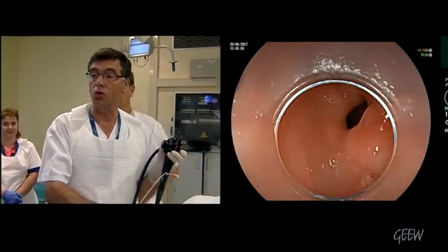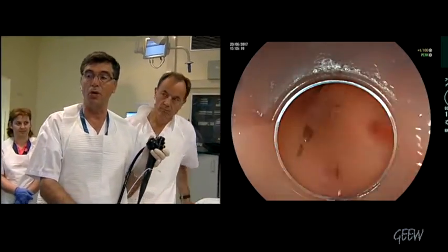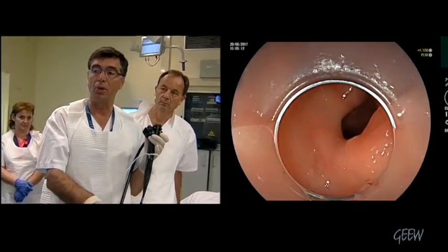We have a small deviation of the pylorus, so we will have to take care when we reach the pylorus there.